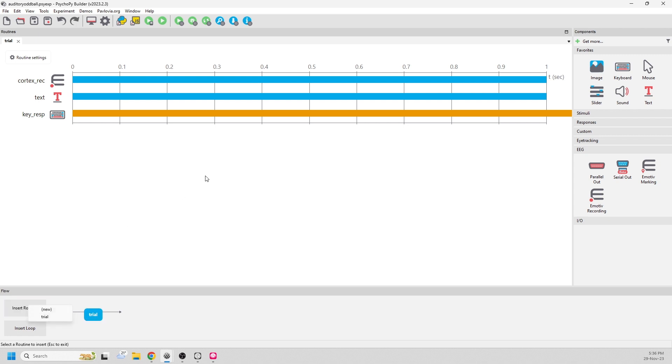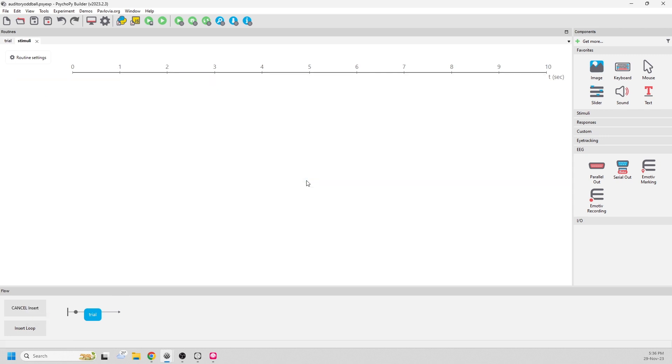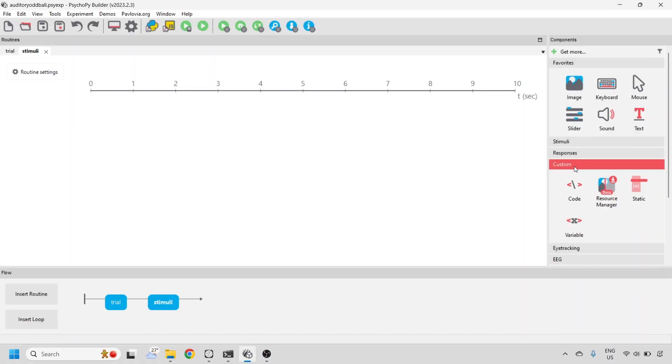Now we'll build a stimuli routine. For this experiment, we're going to build a stimuli using a custom coding component.